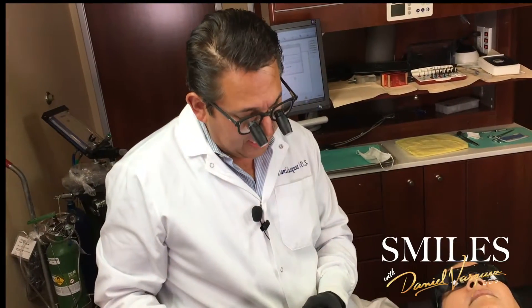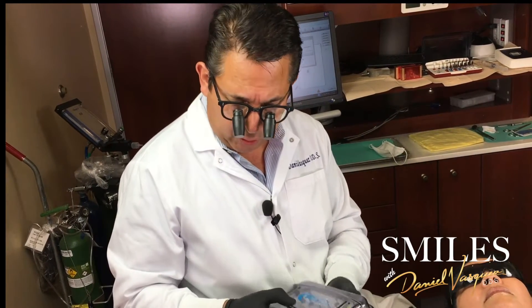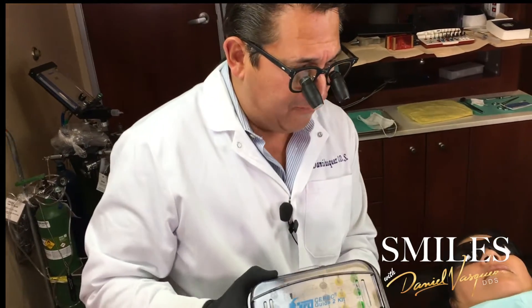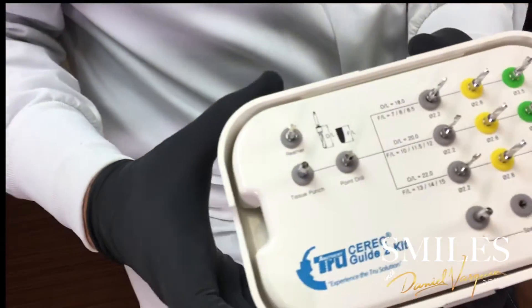Hi everybody, I'm Dr. Daniel Vazquez. Today I'm going to be doing a live patient surgery, and I'm going to be using a new kit — the CEREC Guide 2 kit drills. If you want to come closer with the camera. This is from the company TruAbutment.